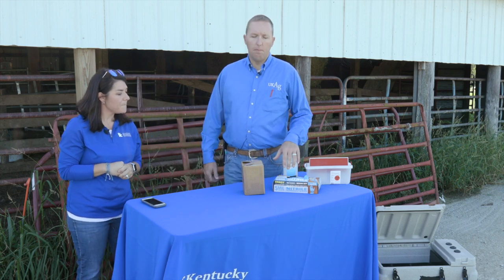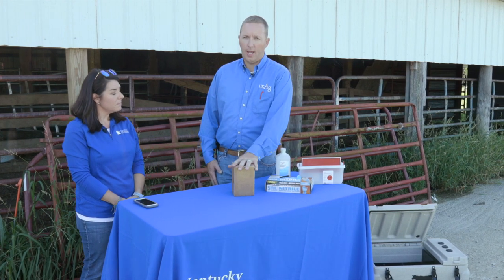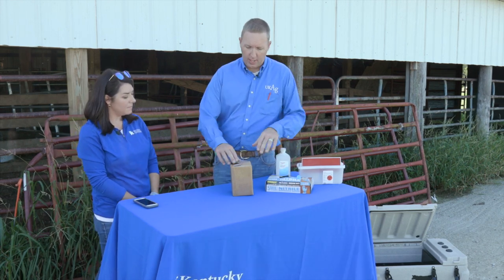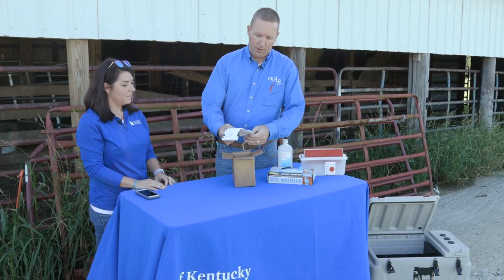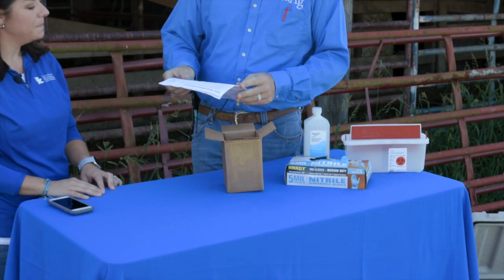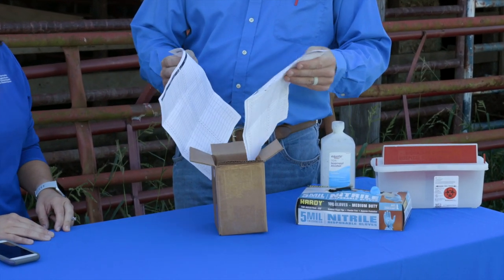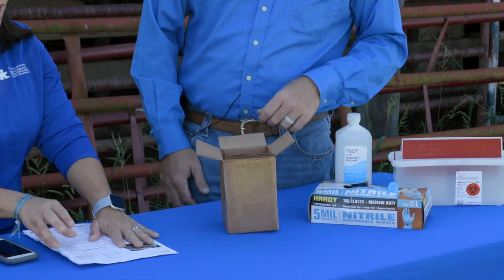You can get these blood test kits just about anywhere — your AI suppliers and a lot of those companies carry them. They essentially ship you everything you need in a box. When you open it, the first thing you'll find is a set of instructions, which are really handy to follow. It also has record-keeping sheets and tells you how to label your blood collection tubes.